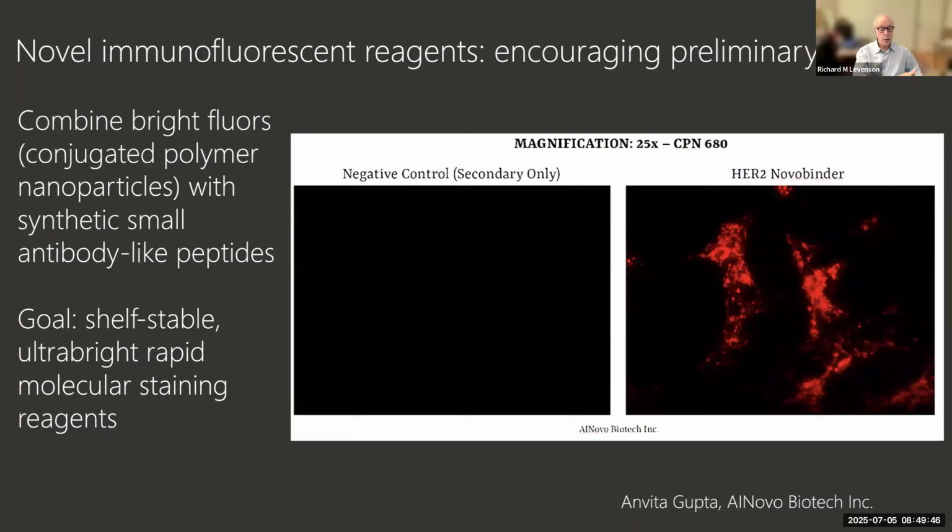Now, all right, so that's that whole story, why we developed this rapid technique and how it might be useful in various settings. And just one other thing, we're trying to add to its capabilities because, as I mentioned before, typically what people do is not only do the histology, but they also try to do some level of immunocharacterization.